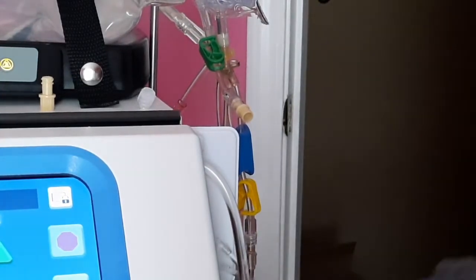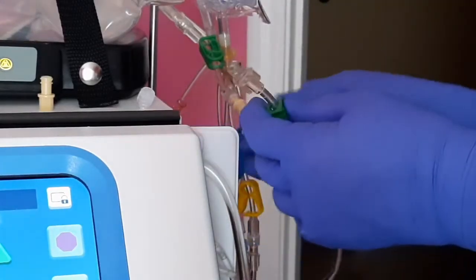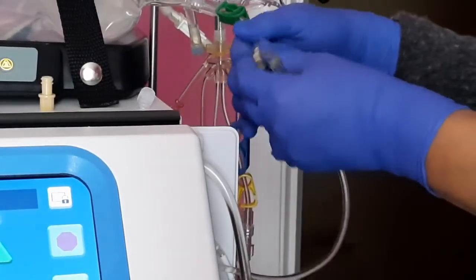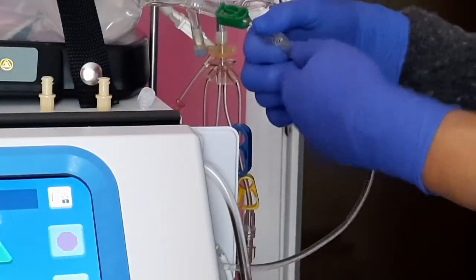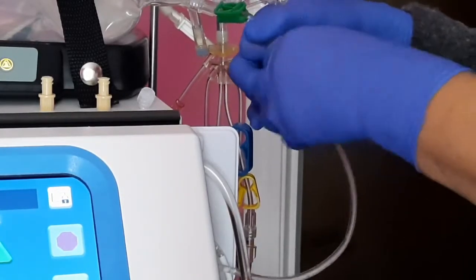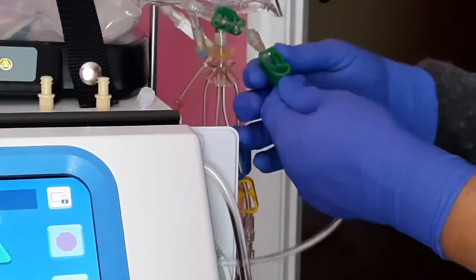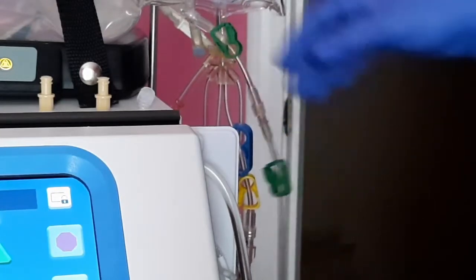All right, so again, you take your dialysate line that you just disconnected the saline line to. You find your dialysate line that's attached to your dialysate bag on the warmer. You take that off. Take the cap off of that. Make sure they're both clamped now or you'll get squirted. All right, and then you connect these two together. Make sure that's nice and tight. Now you unclamp both of these lines. Okay, so that's the first line you have opened that was previously clamped.